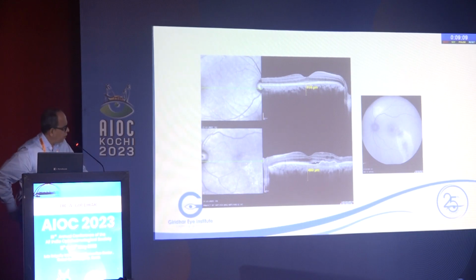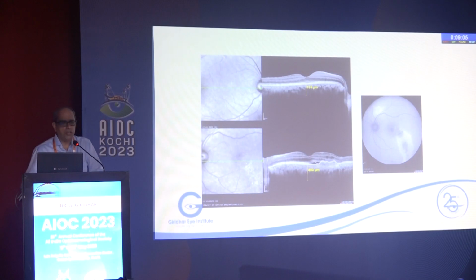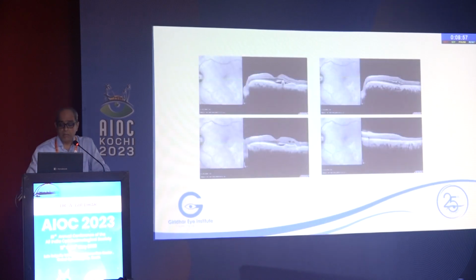So, pachychoroid, yeah, he's got a little pachychoroid and you see a little bit of an elevation of the retinal pigment epithelium, what we call as a FIPED or whatever double-layered sign, whatever you want to see, and that area is little hypertrophic. Now, I'm taking multiple sections. Whenever you have a machine and whenever you have a disease, you must analyze the OCT not with one picture, one scan, but all the scans together. Otherwise, you will miss something.